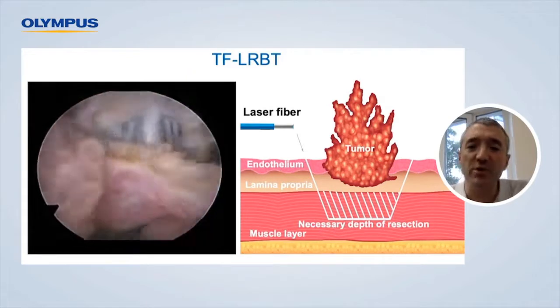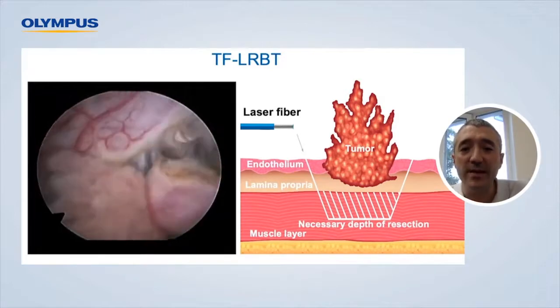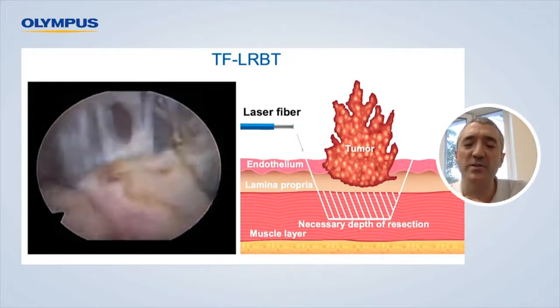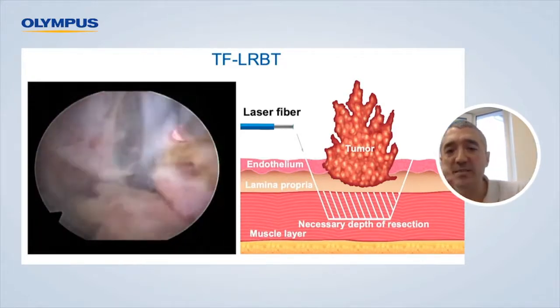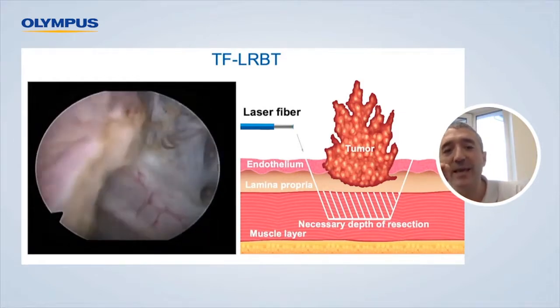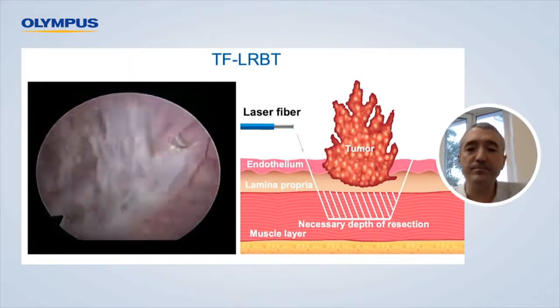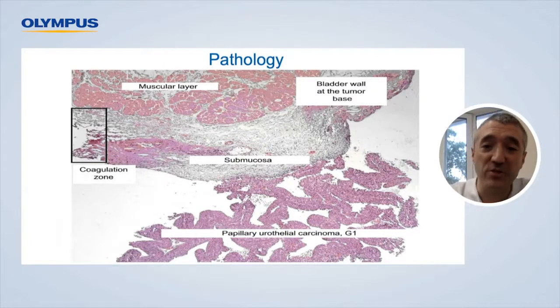After we complete the circle incision, it is possible then to go under the tumor. As you can see, the laser allows for making precise and effective incisions without burning the tissue, so that all the layers are clearly visible. And also, you may see how delicately the laser separates muscle fibers. And of course, who is especially satisfied with this technology is our pathologists. You may see that the laser effect on tissue and the coagulation zone are minimal.